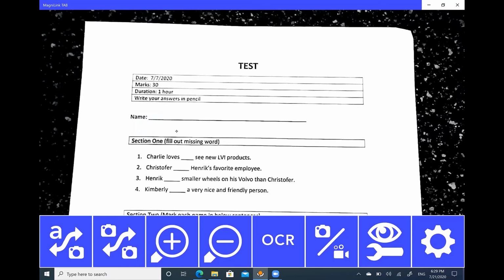So I'm going to finish off with another feature that we've added, and that's the ability to use Narrator. We had quite a few people say, you know, this would be really cool if Narrator worked extremely well with it, because that way, if someone has very low vision and they're showing it off, or someone has no vision or just light perception, they still have the ability to show this product off. Because in certain states, they may have a person that does low vision evaluation, and that person may be totally blind, light perception, or very limited vision. And so it's very important that they're able to use it. So I had a lot of people say, well, we wanted to work with Narrator because it's on a Windows 10 machine, and this is Windows 10.